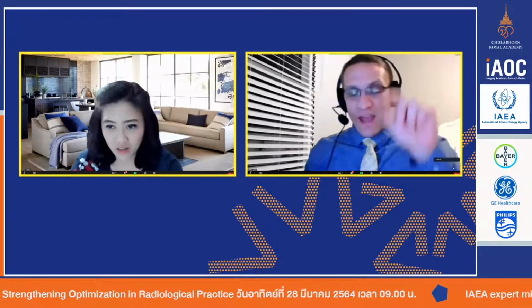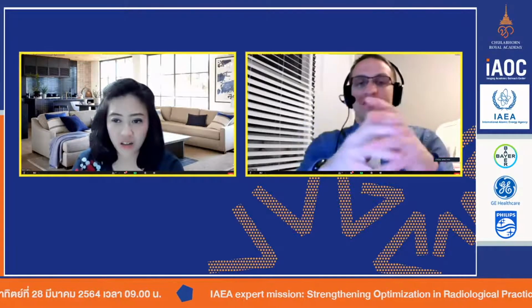But photon counting is inherently the same as dual energy. Because we can count the number of photons, we can also calculate the energy of the photon as it strikes the detector. So instead of doing dual energy, one energy and two energies, in photon counting you can calculate all of the energies on that spectrum. So dual energy CT is actually the stopgap. We go from single energy to dual energy. And once we figure out dual energy, when photon counting comes in, that's going to revolutionize the way we do CT imaging. So yes, I think that we will all eventually move towards dual energy CT imaging.